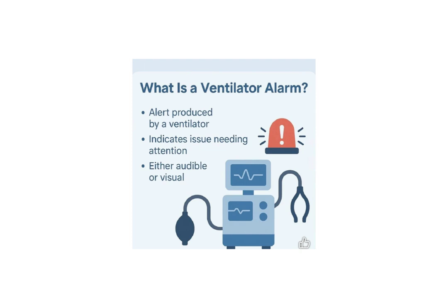Now let's quickly go over ventilator alarms. They alert us when something needs immediate attention. Ever heard that loud beep in ICU? That's a ventilator trying to tell you something.